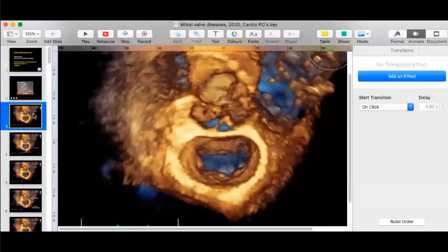Now, this is something from the 3D. So can we have some questions and responses from your side? Quickly, we can just brush up the anatomy. So what leaflet would this be? The one which I'm showing? Okay. That would be the posterior mitral leaflet here. And these are the three segments which you see here of the posterior mitral leaflet. So which segment would this be?